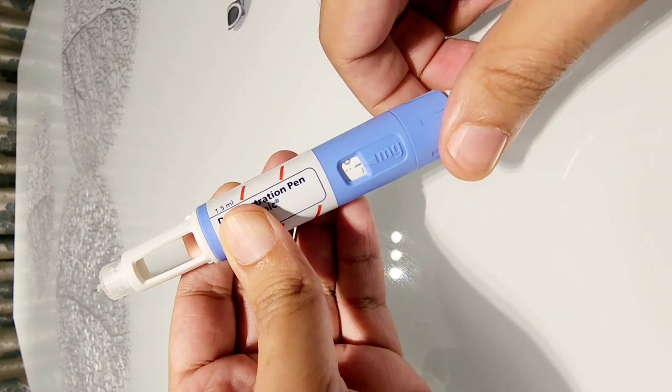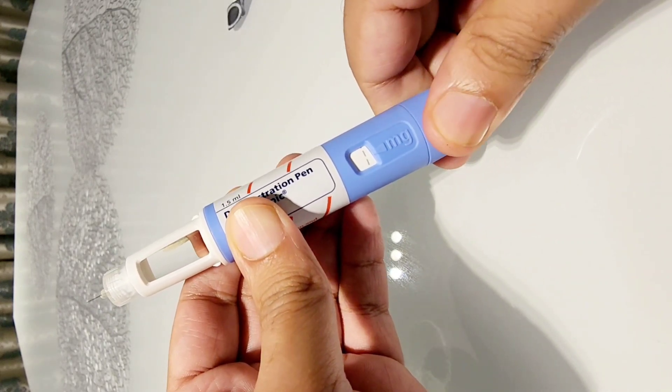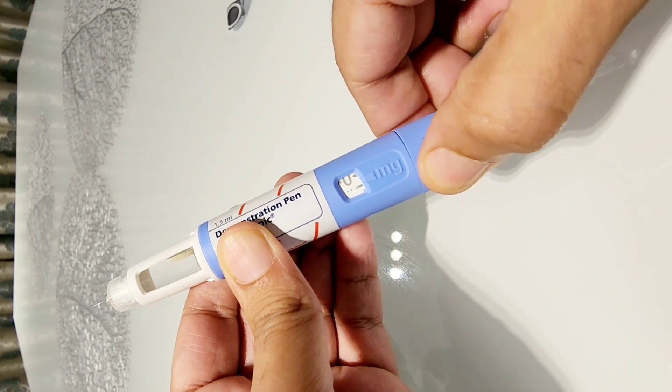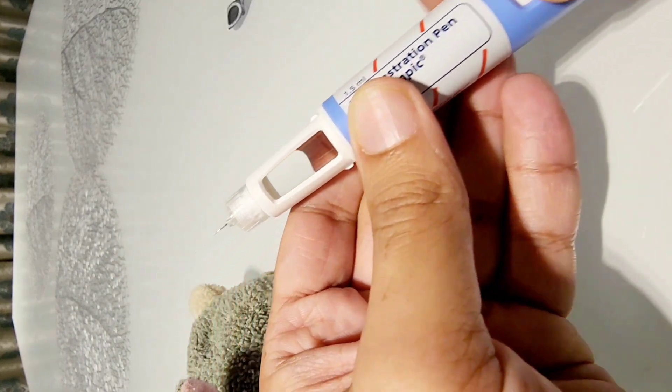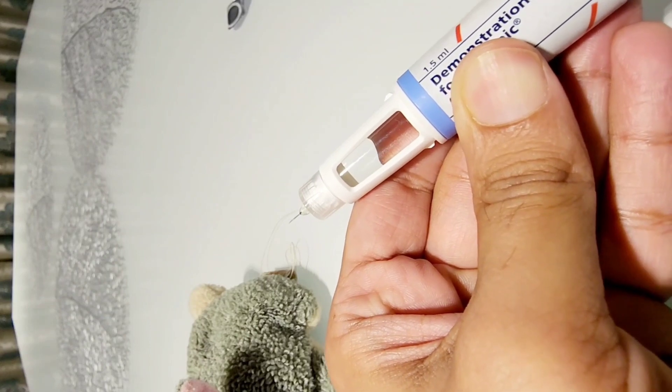So there is a small mark here as you can see before this segmented line comes. This is between zero and this mark here. This is a test dose. So you can actually do a test dose and make sure that there is a drop coming up.